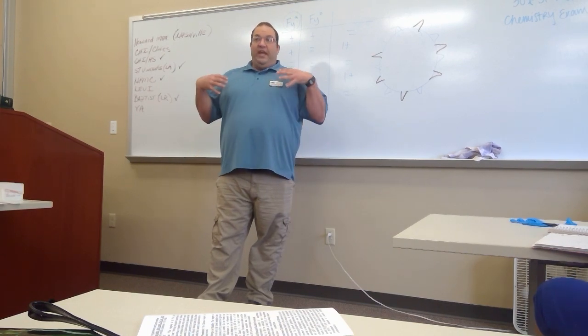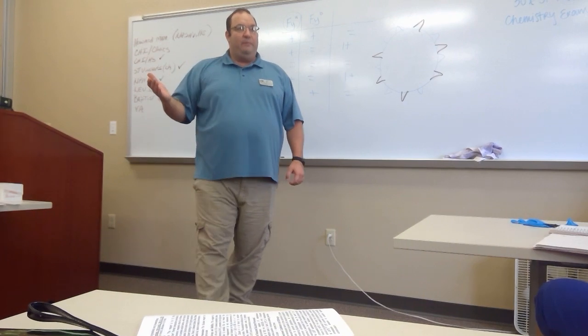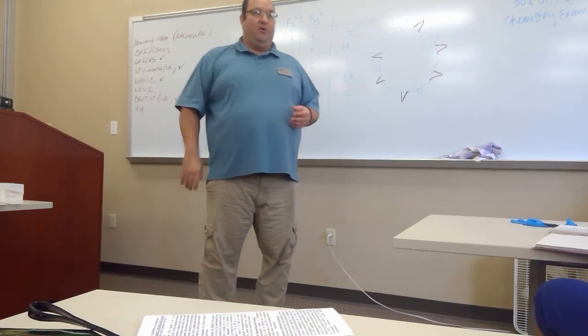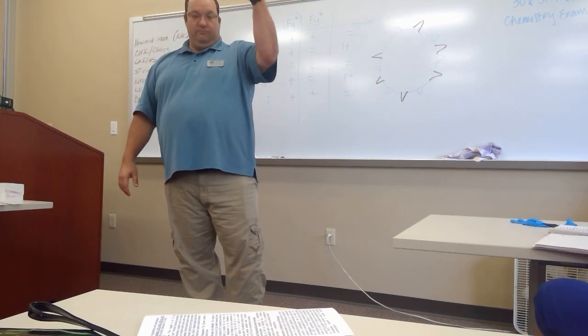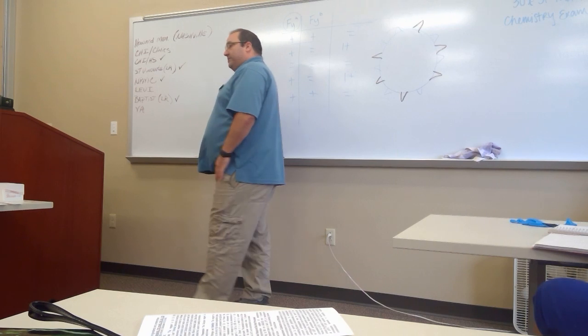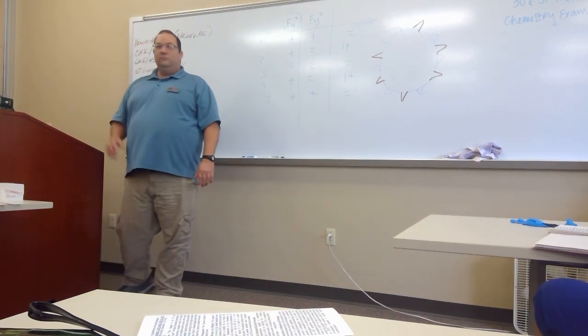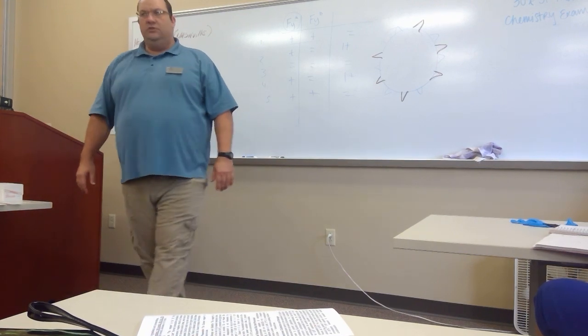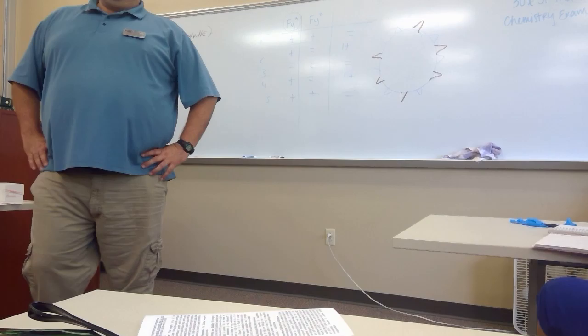Because if we ever order and request, like, Duffy A negative units to give to a patient, they ask you for the patient's name and date of birth. That way they'll go ahead and put a record of it that we already know. They don't have one on everybody, but a lot of patients, they have history. Once you get a weird one, they want to keep track of it. That's all I got today. Like I said, tomorrow, all we're gonna do is practice panels.